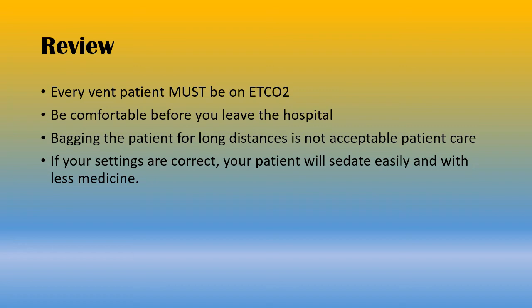Make sure you're comfortable before you leave the hospital. This goes back to what we talked about before when we were talking about doctors dumping train wrecks on you. Sick people go to small hospitals all the time. Some people just don't ventilate well. Some people you won't have the knowledge without taking a week-long class on ventilator management to be able to fix them enough to keep them stable to take them to the other hospital. So be comfortable before you leave.